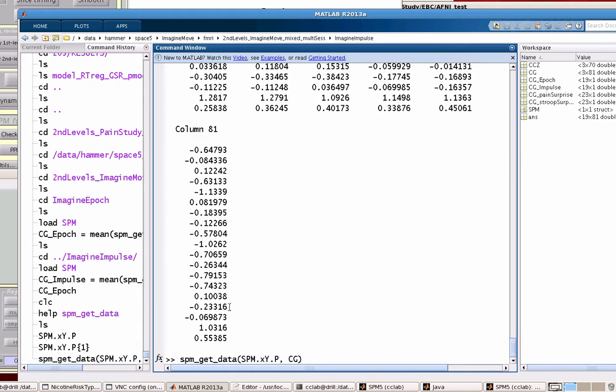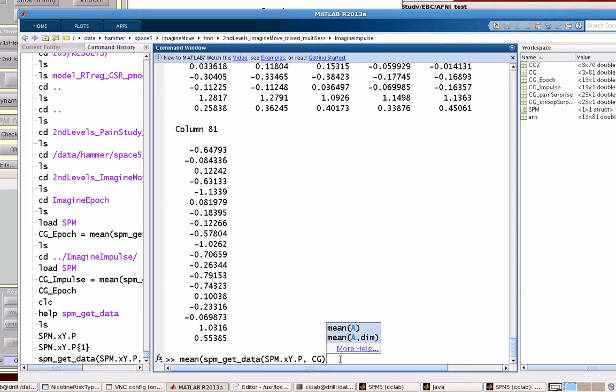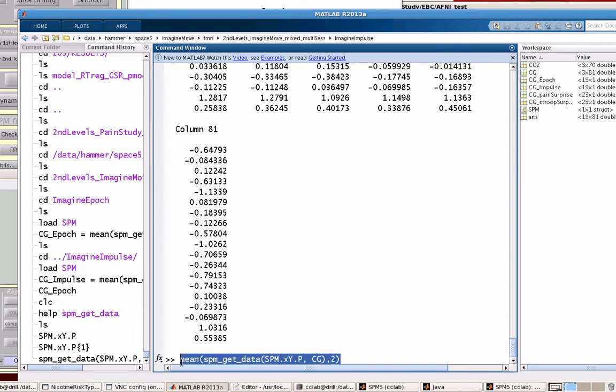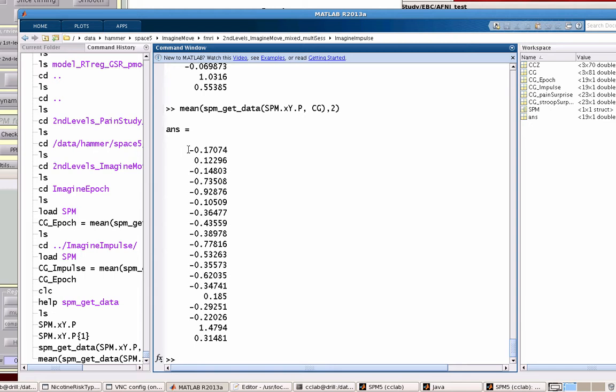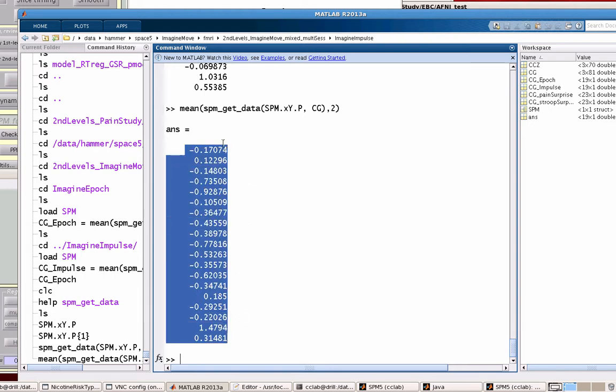Now it's going to give you 81 columns because it's one for each of those voxels. We don't necessarily want that - usually we want to average across every voxel within an ROI. So I just append mean to this, and then we're averaging across each voxel. That's what the two represents. Now what we're left with is an average for each subject for that contrast across that ROI.